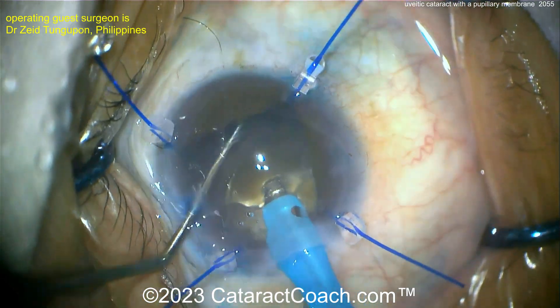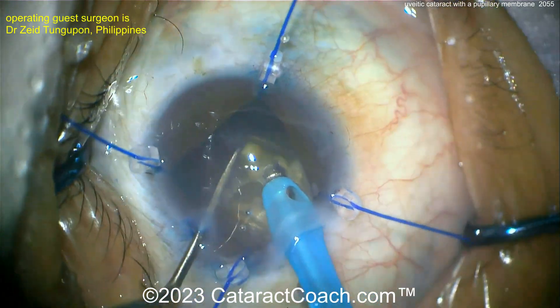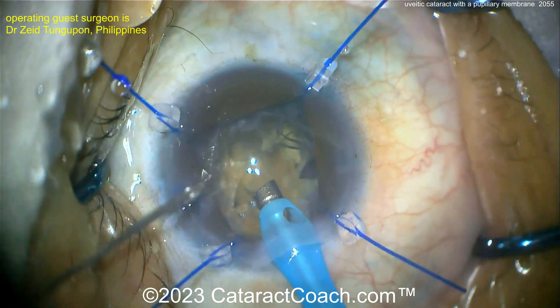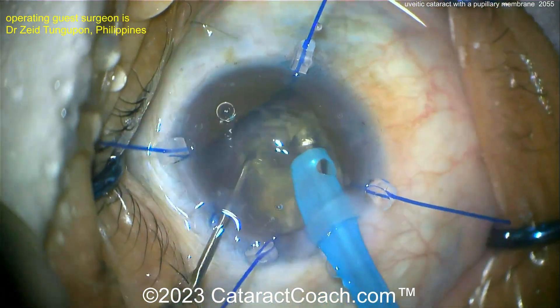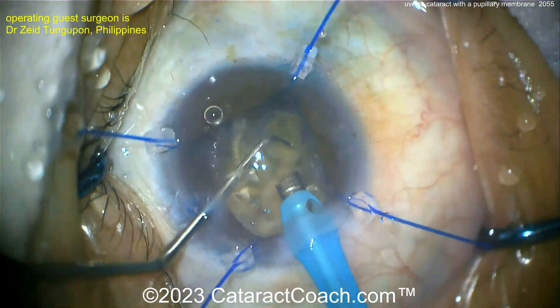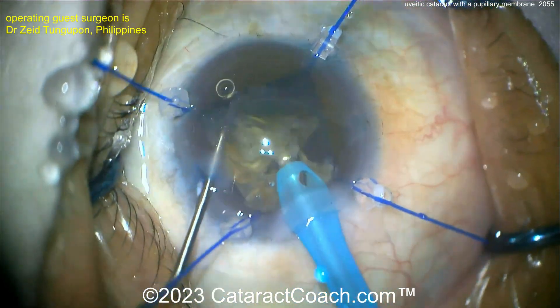For these eyes, I like to make sure the uveitis is quiet and well-controlled for at least a few months prior to surgery. You really want these eyes clear, at least of anterior chamber cell. Some patients will always chronically have some degree of anterior chamber flare, and you may just have to proceed with cataract surgery. We can also minimize the inflammatory response post-op by putting in more steroids. Would you do MSICS instead of phaco in this case? You could, but you may have a little less inflammation with smaller incisions and perhaps easier healing compared to the larger incision of SICS. Either would be appropriate.